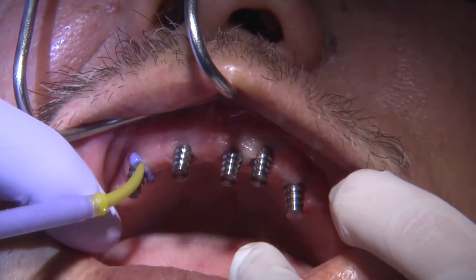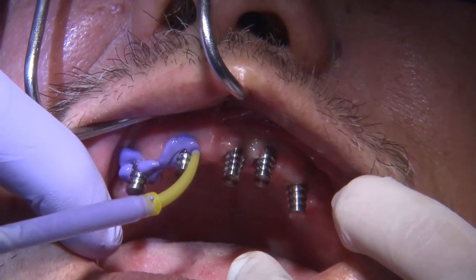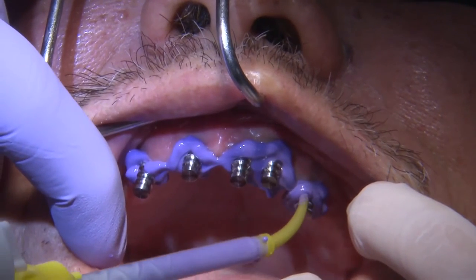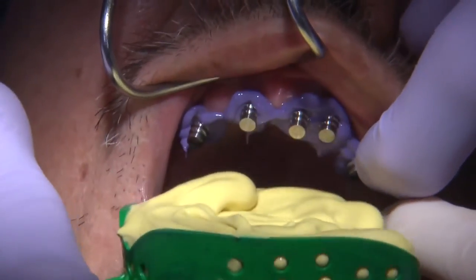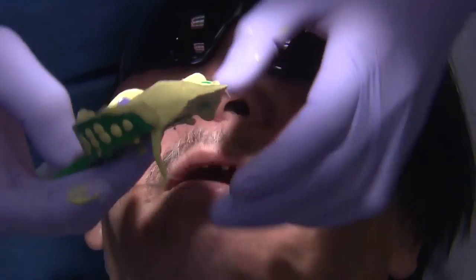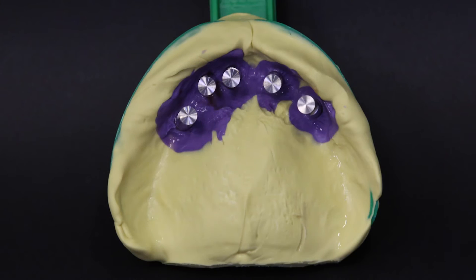Once we have the impression copings in place, I can capture a preliminary impression, which I will send to Glidewell for the fabrication of the implant verification jigs. Alternatively, you can skip the preliminary impression and, utilizing open impression tray copings, connect them in the mouth with floss and GC pattern resin or composite, then capture a final impression with an open tray technique using a stock tray.